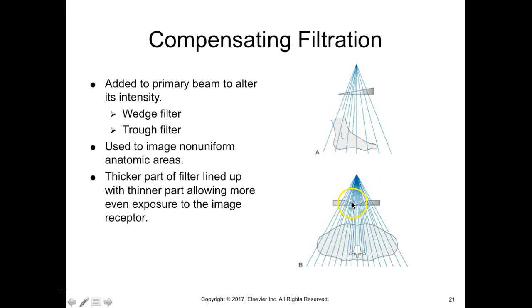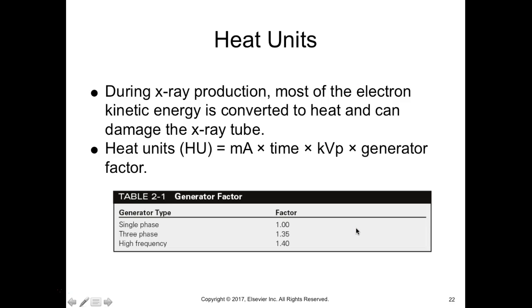So here with the trough filter, the mediastinum is pretty dense, so the lungs are not. So we'd use a trough filter, this is called a trough filter, so that we could see the lungs and the mediastinum properly exposed.